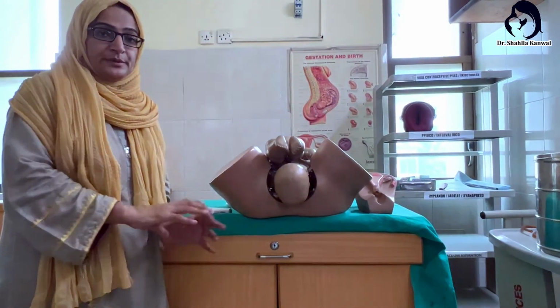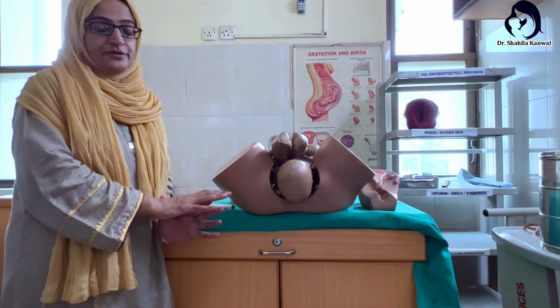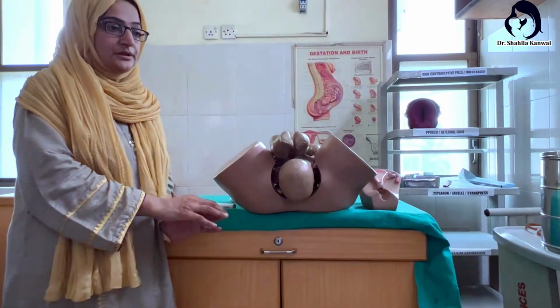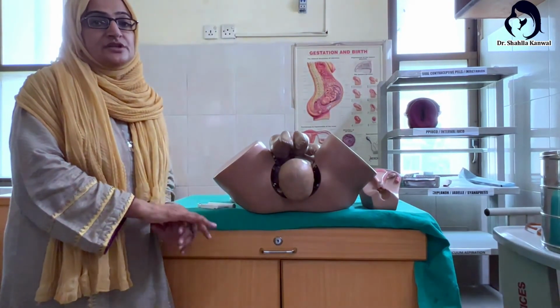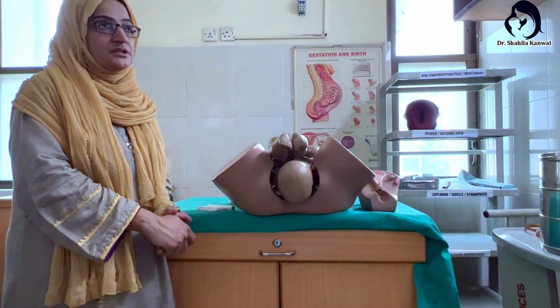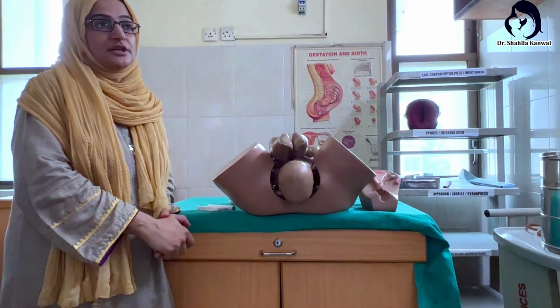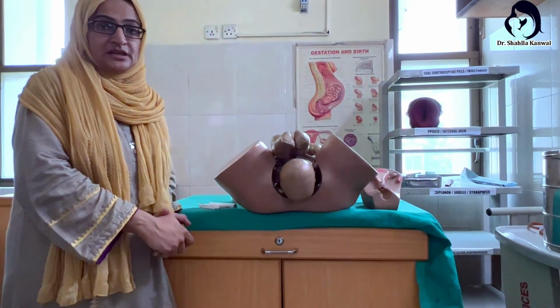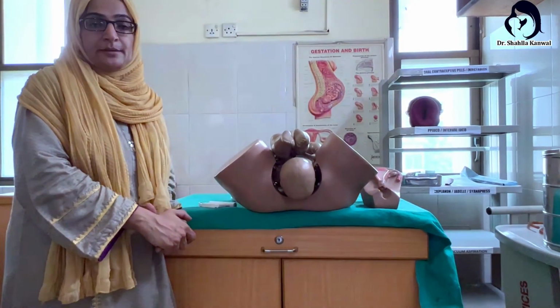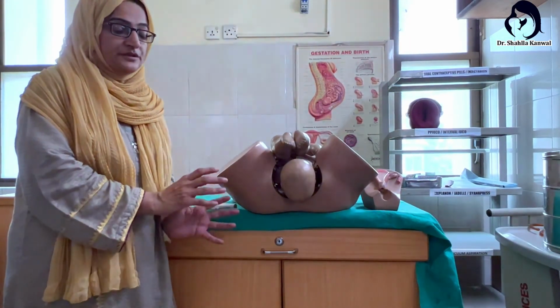After the delivery of the baby and the placenta, you have to check for any kind of lacerations, any kind of tear, and if there is an episiotomy, stitch the episiotomy in the usual fashion. But after the delivery of the baby, you have to check for any complications. These complications could be like chignon, subgaleal hemorrhage or intracranial hemorrhage. This is after the delivery of the baby with the Omni cup.